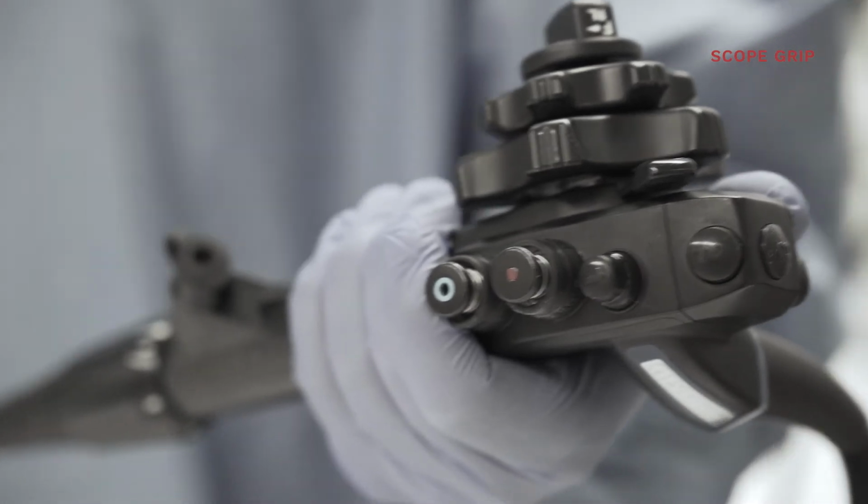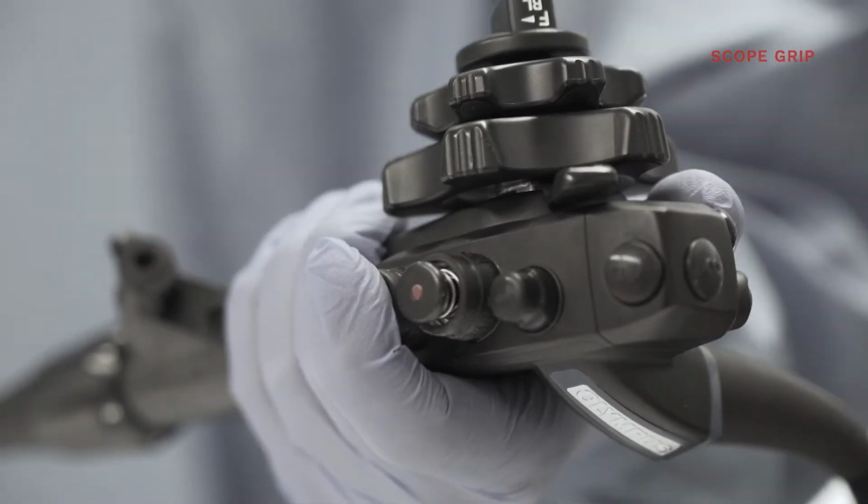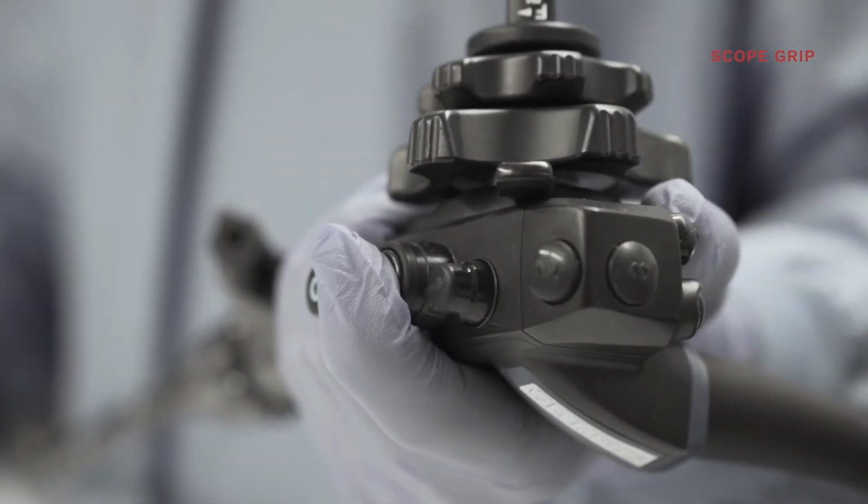Although many of us were trained to keep our index and middle fingers resting over the two buttons, it is preferred that neither finger rest over these buttons, and that they be pressed only when required with the index finger. This avoids inadvertent overinsufflation during insertion.